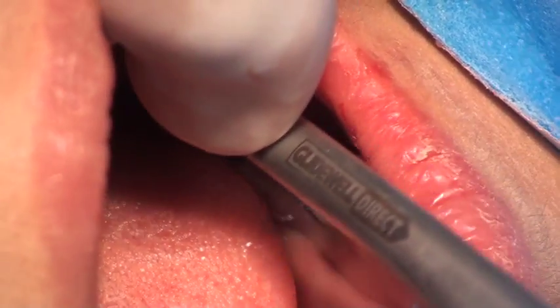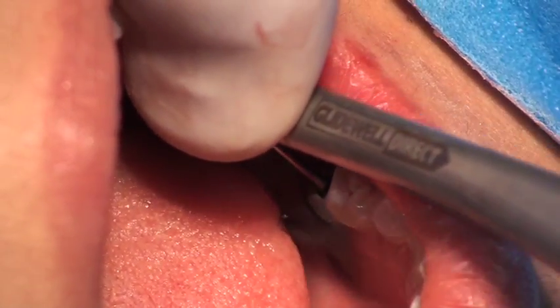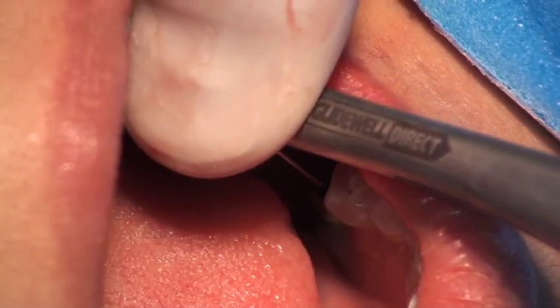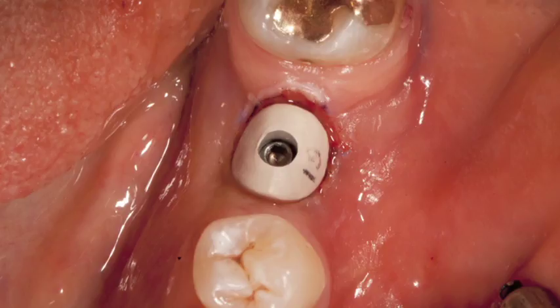The decision was made not to immediately provisionalize the case but to place a healing abutment. He's placed the custom healing abutment and is now torquing the abutment screw to 15 newton centimeters. The healing abutment is made of PEAK, which is a polyether ketone — a plastic — so you don't want to crank down the torque, but 15 is plenty and nothing's going to come loose.